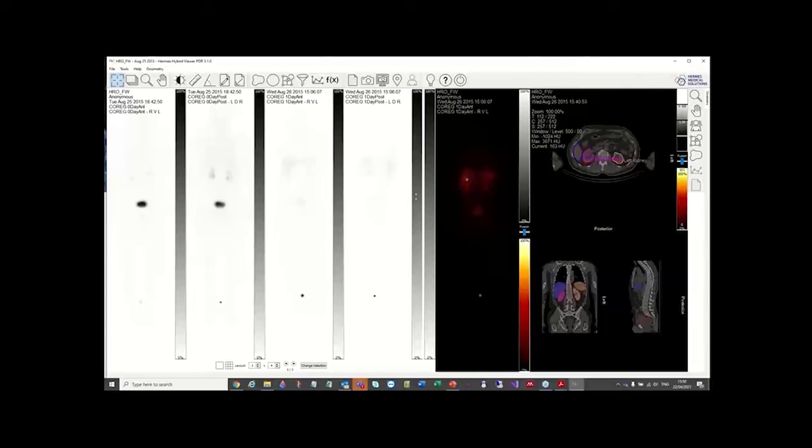And Olinda, of course, uses the MIRD model, which contains many assumptions, one of which is homogeneous activity distribution in the liver or in all organs. It can't represent, at least in this program, a voxel level.